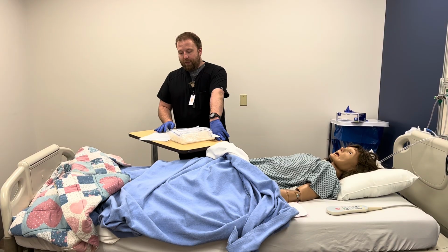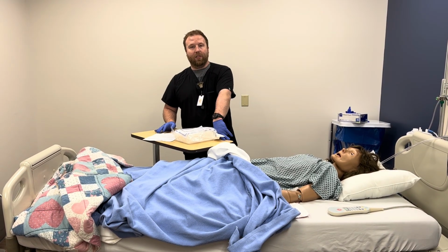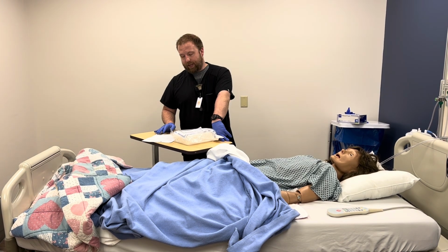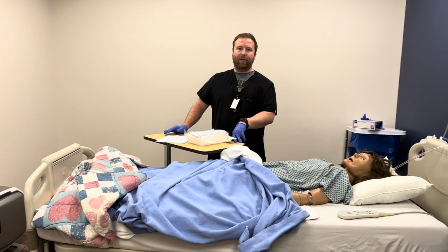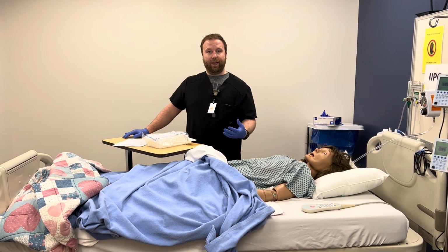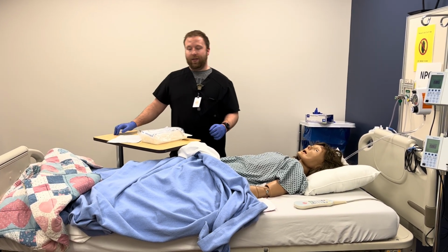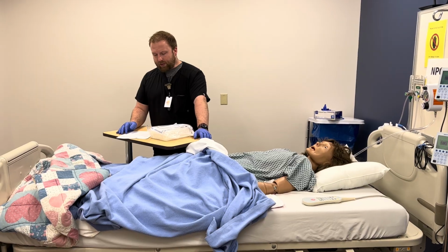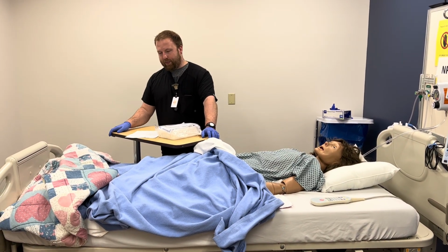When might you not be able to place a Foley? You may have difficulties with an enlarged prostate. That can become difficult as you're trying to place a catheter. Whenever you pull back and you see, maybe after a traumatic incident, blood at the urethral meatus, you're not going to want to insert a catheter because we don't know the extent of damage done inside the urethra.